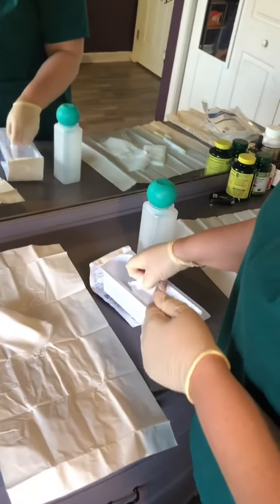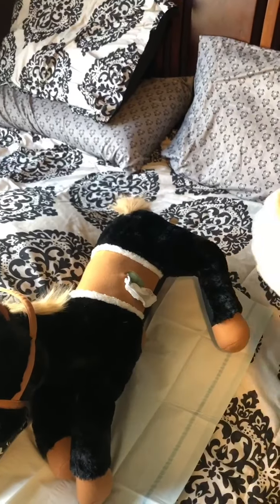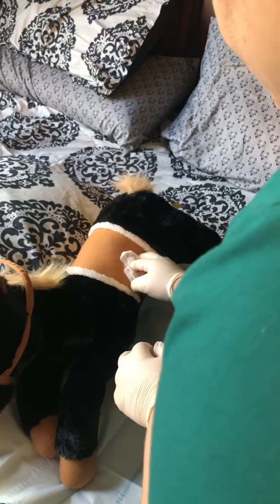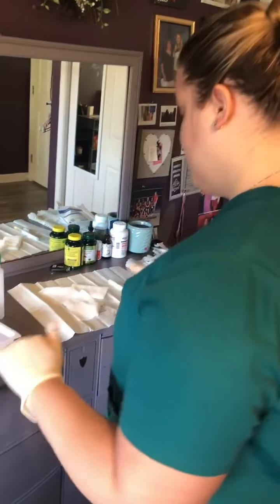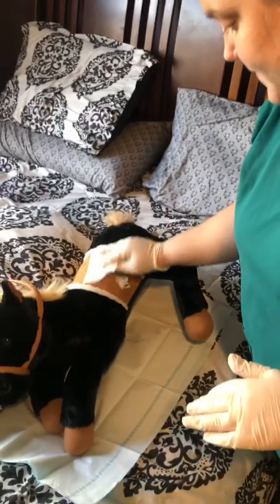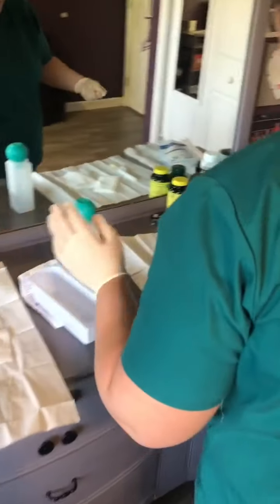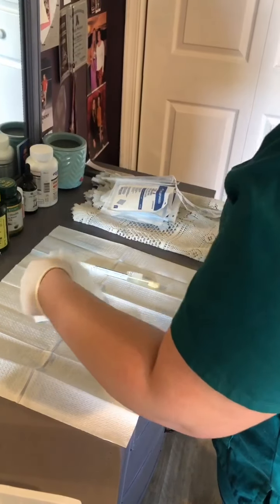I'm going to need one more. Fluff that. That's also going to go. So I'm going to note that I put 2 4x4s inside of the wound, and then I'm going to make sure the surrounding area is dry. And then I will redress the wound.